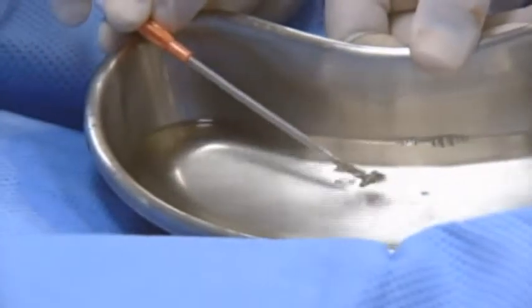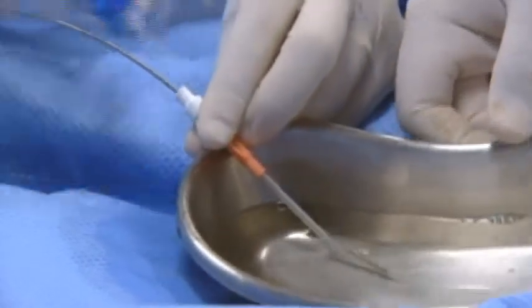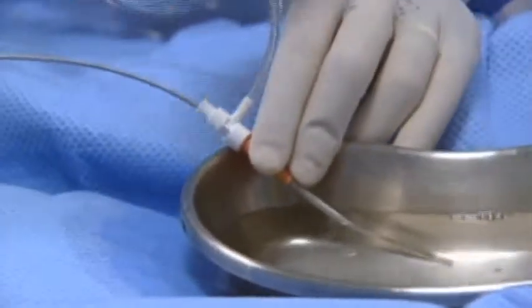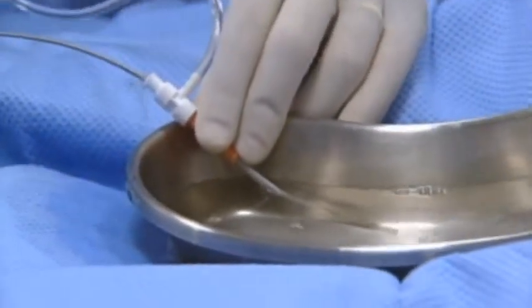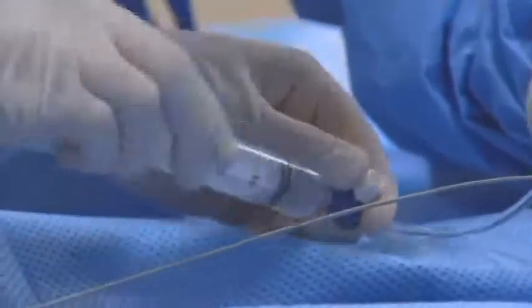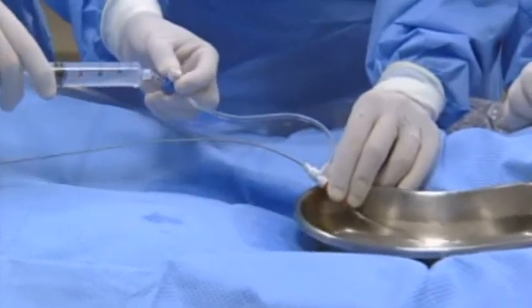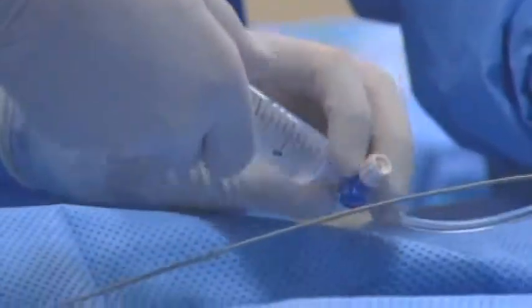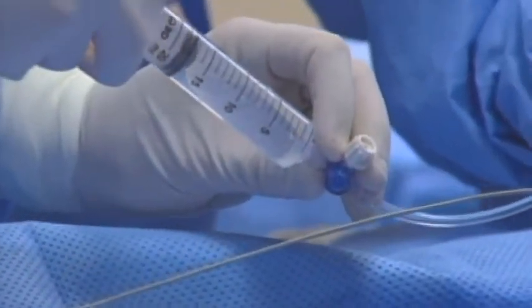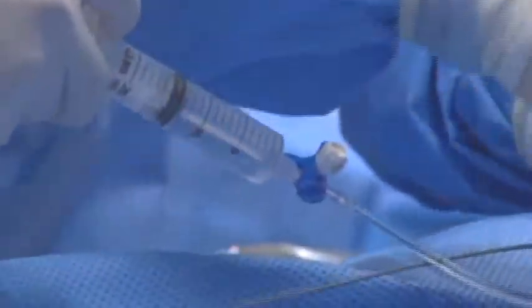Yeah, let me show how we load them. It's going inside the loader. The loader is transparent. Rodrigo is flushing very gently. Again, as soon as we de-air the system here, we're going to do the transition. See, there was a little bubble over there. You just keep it there.